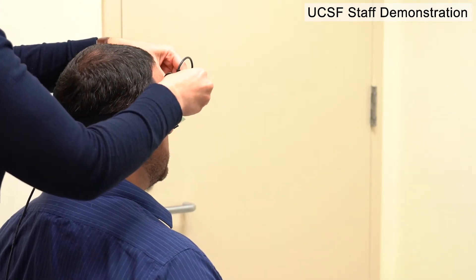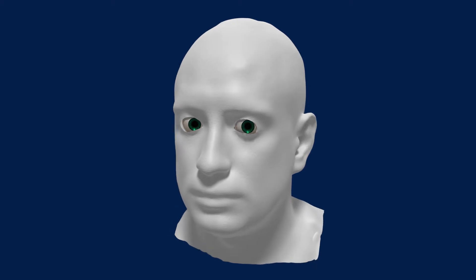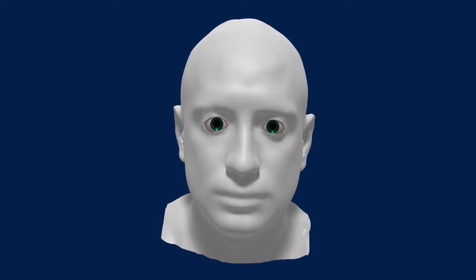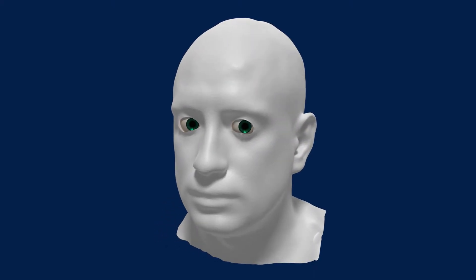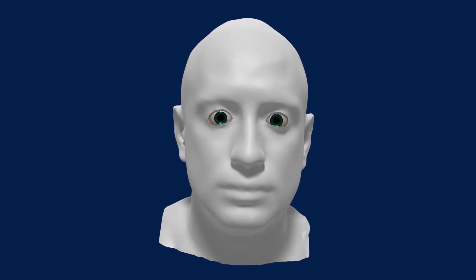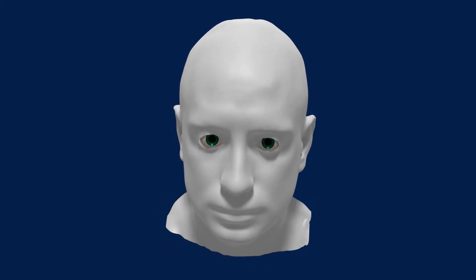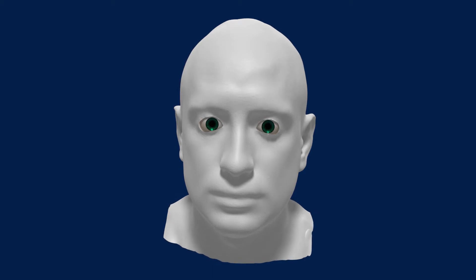Why measure the eye movements? One of the important functions of the vestibular system is called the vestibulo-ocular reflex. When the vestibular system senses head motion, this reflex causes the eyes to move in their sockets to compensate for the motion, which allows them to smoothly stay focused on a stationary object.